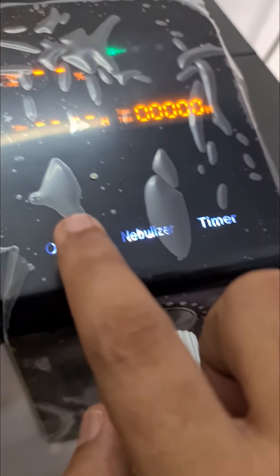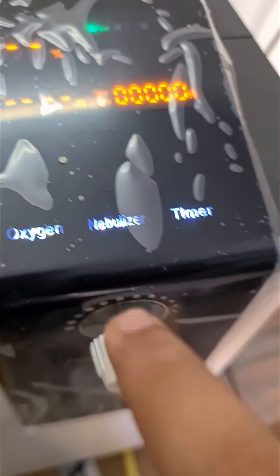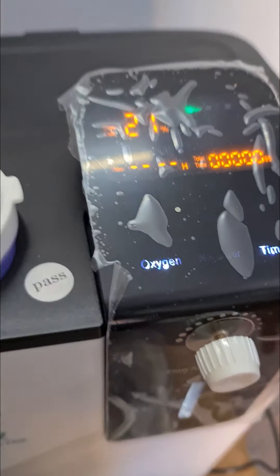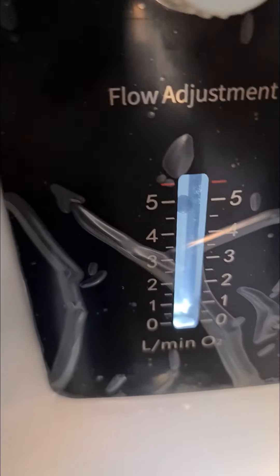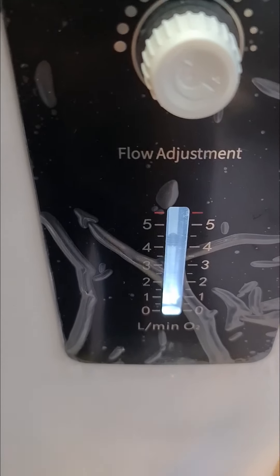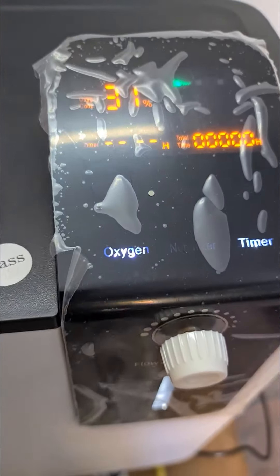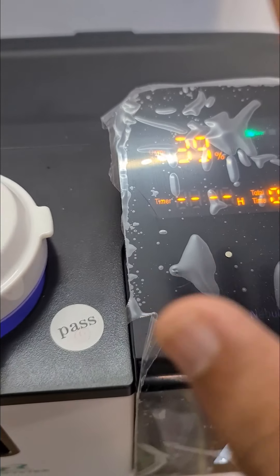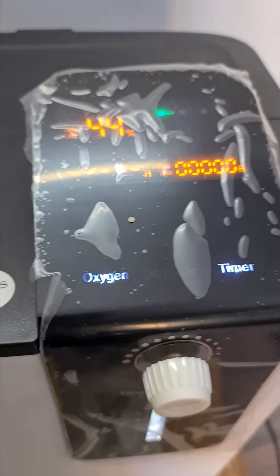The touch screen is very sensitive. If you want to get the oxygenation, press the Oxygen button. Instantly you can see the machine has started to boot up. This is the flow meter — you can see the ball rising up. Set it to whatever level the doctor has prescribed for you, whether 2, 3, 4, or 5. It's a medical-grade concentrator, so between 1 to 5, whatever flow rate you keep, the machine will go to 93%. This will show you the digital oxygen concentration. Wait at least 5 minutes for it to come to the maximum value.